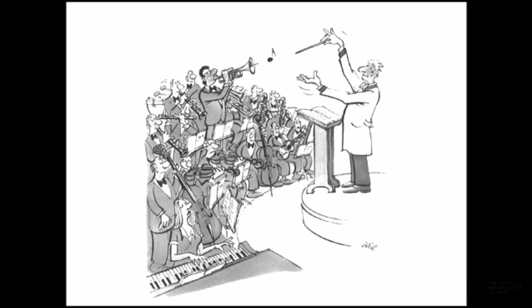If I then asked one side of the room to sing with a different pitch and slightly vary that pitch across the room, at any one point in time I can ask someone what's the next word they're going to sing, at what pitch, and I can now say that you're sitting in that seat there. That's essentially what we're doing with our slice select, phase encoding and frequency encoding. We're finding a way to represent where an individual pixel within a matrix sits within the body.